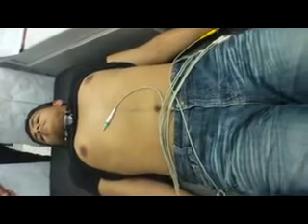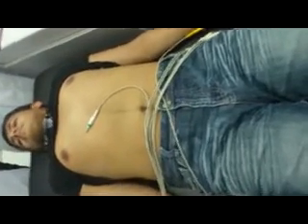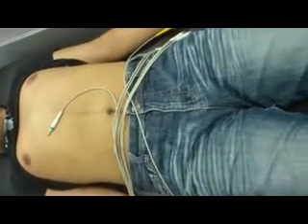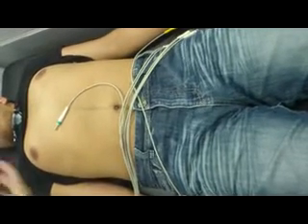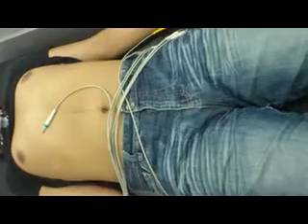How do you count? If there is some problem, for example an obese person or a female patient, and you cannot count, what you will do: if you don't know how to count the ribs, just attach V1, V2 on the lower end of the sternum, one on the right and one on the left. This is the sternum, lower end, with rib number 6. You understand? Yes. Approximately.